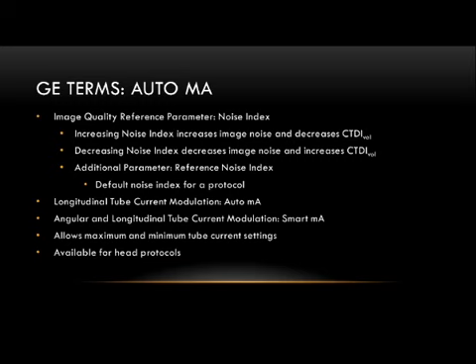Longitudinal tube current modulation is typically called Auto mA. Angular and longitudinal together are called Smart mA, and GE does allow you to set minimum and maximum tube current settings, and you can use tube current modulation on head protocols for GE systems.